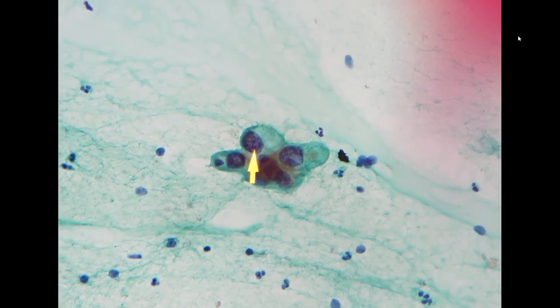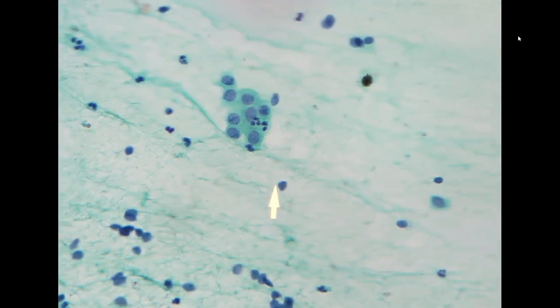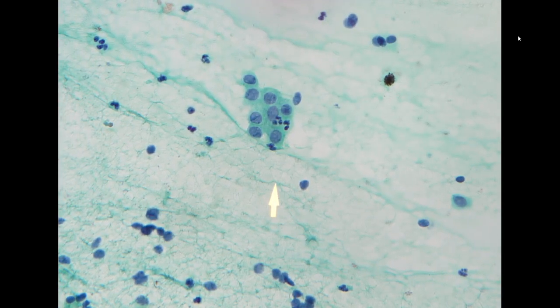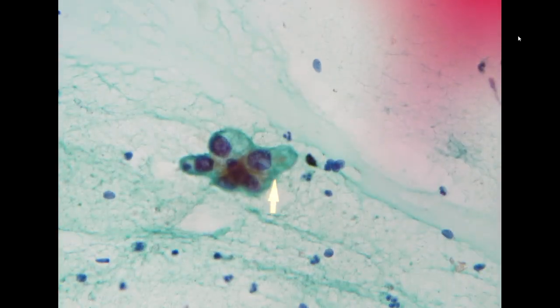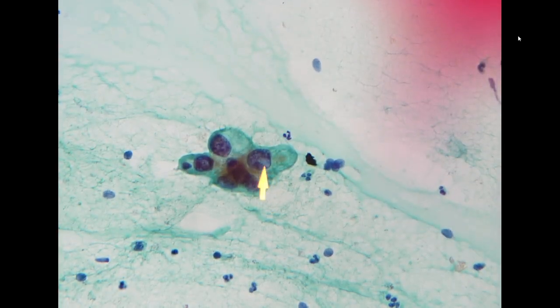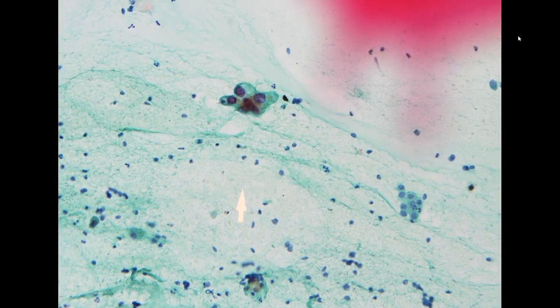The nucleus is big. The chromatin is very irregular and hyperchromatic. Compared to the adjacent cells, which should be the usual endocervical cells with usual chromatin, this is hyperchromatic, and you see hyperchromasia and polymorphism. So I think it already exceeds atypical glandular cells. We can call this favor neoplasm.